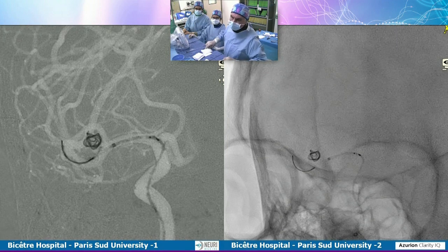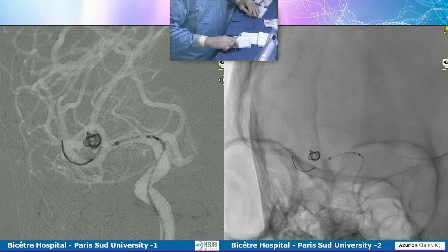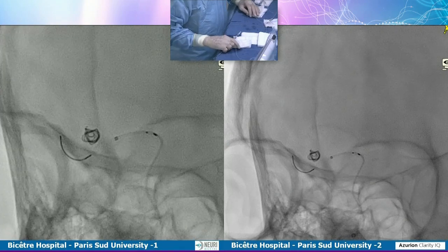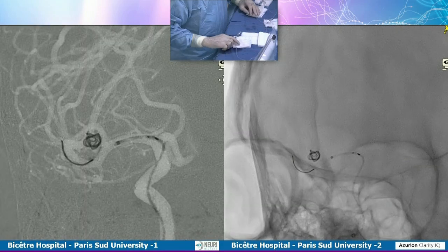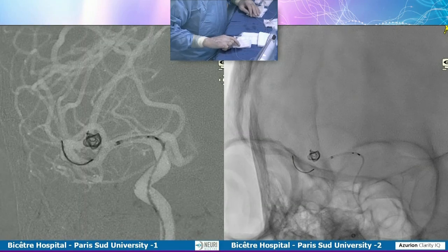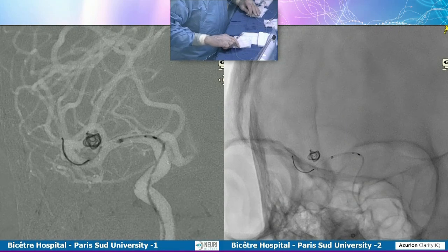And when there's a lot of inflow from that upper branch, for example, as was pointed out, that aneurysm is truly a superior division aneurysm, not a true bifurcation aneurysm. That may keep that aneurysm patent. And even if you tell me there's flow modification and those aneurysms will never rupture, we really don't know that in the long term. So I think it's a good idea to put a coil there.